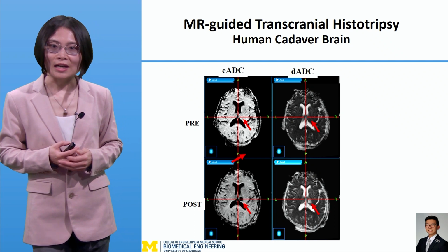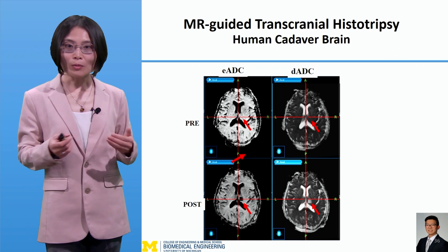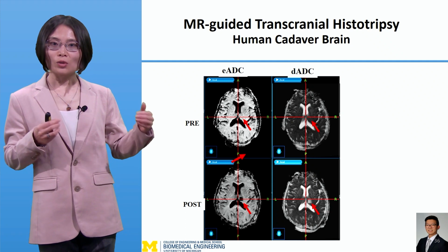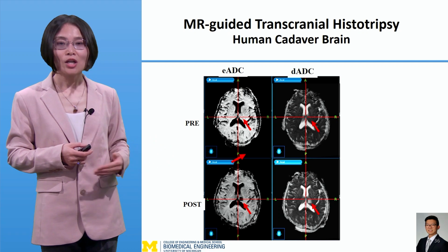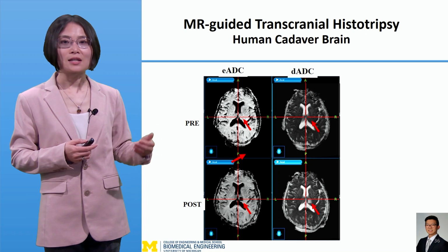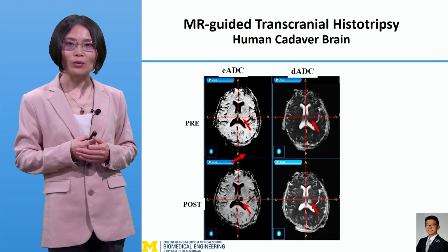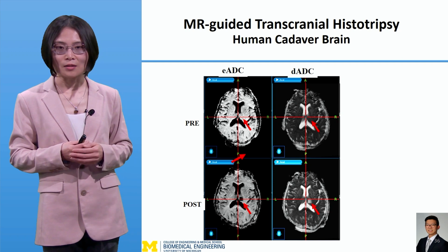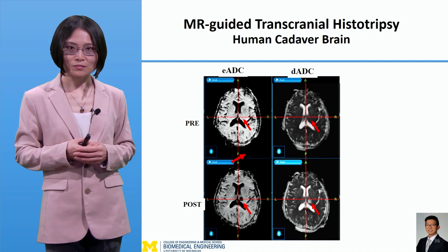It's worth noting that because histotripsy uses bubbles to mechanically fractionate tissue, we can use a really long wait time between pulses, or a low duty cycle, to minimize skull heating. By mitigating the heating of the skull, this allows histotripsy to potentially treat a wide range of locations within the brain, compared to the limited treatment location profile of thermal HIFU transcranial treatment.